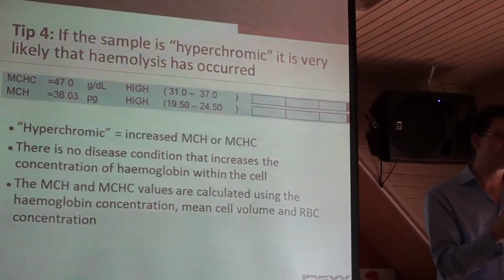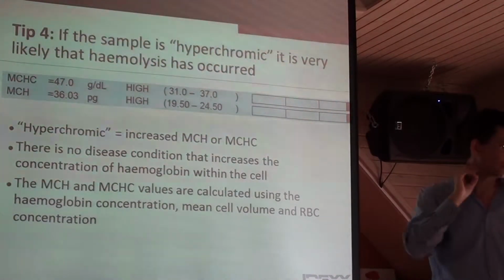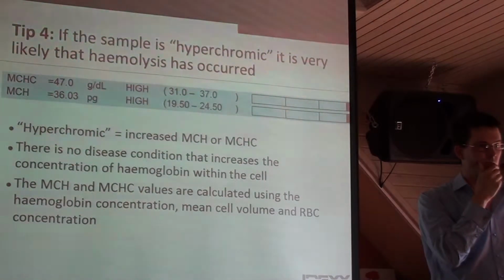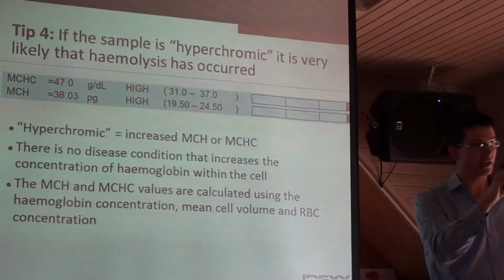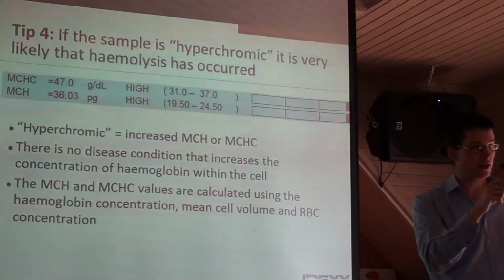In England, I was called to a practice that was consistently having high values for these parameters. They had changed from a good quality needle to a cheaper needle that had a rough internal surface.